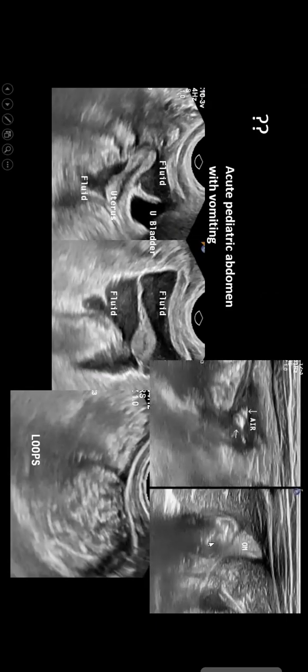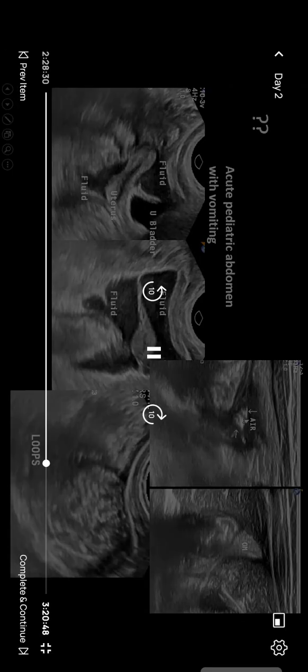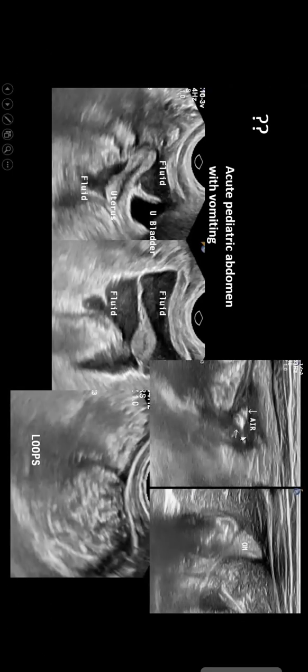On thorough examination, I could see there is a small area of interloop thickening with small omental reaction, trace fluid, and extraluminal air. So this is a focal abnormal interloop area with fluid and air suggestive of focal perforation with sealing. As I mentioned, when there is focal extraluminal air, it means there is perforation with sealing. So there is interloop air, trapped air, omental reaction in the local area. This is the zone of transition, and there is formation of some dilated bowel loops, some are collapsed, leading to obstruction as well.